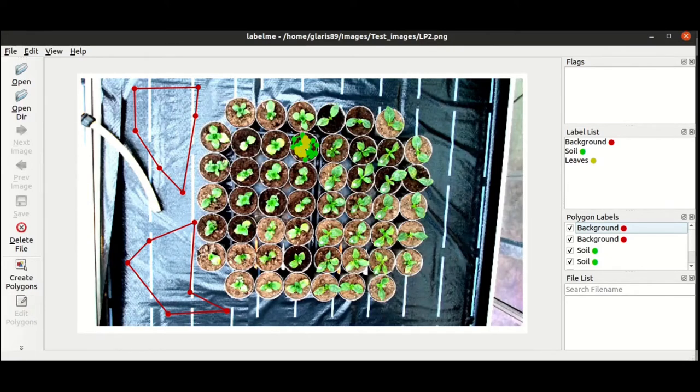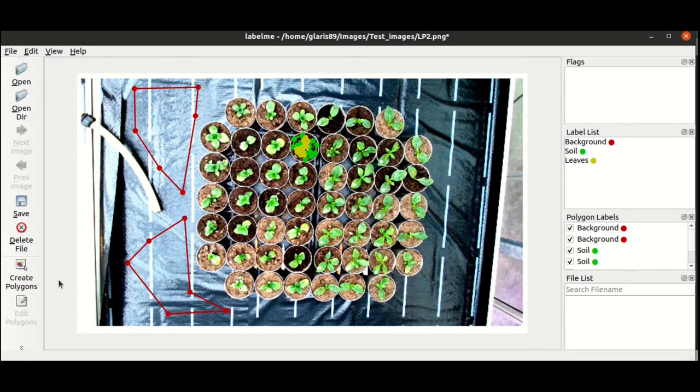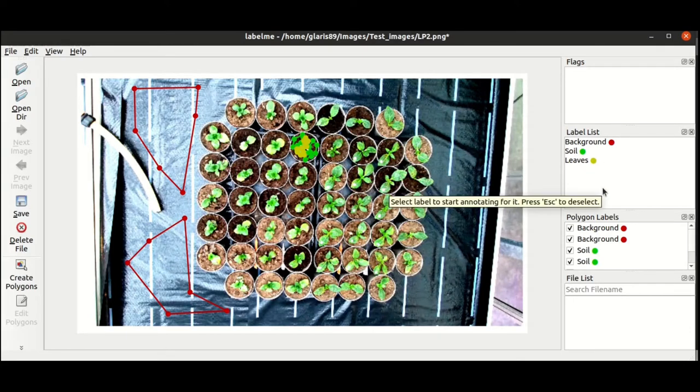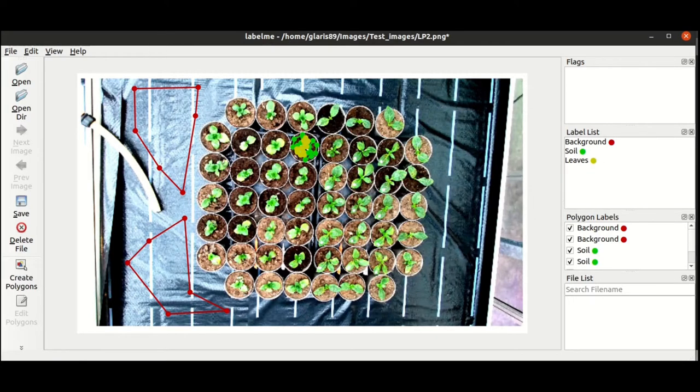So when you do that, you can also edit your polygons and save it again as you want.